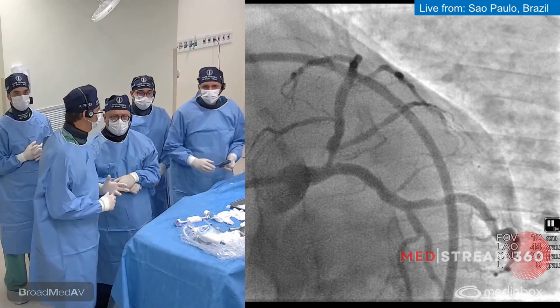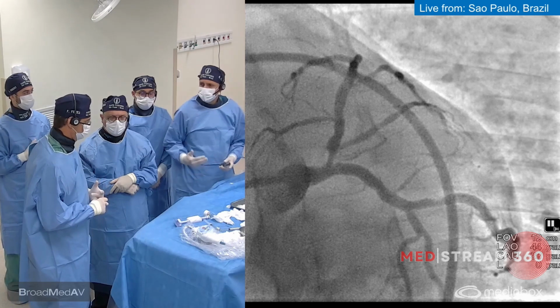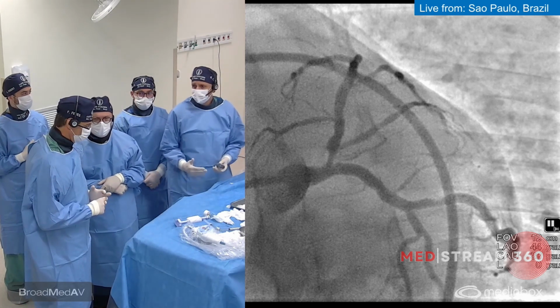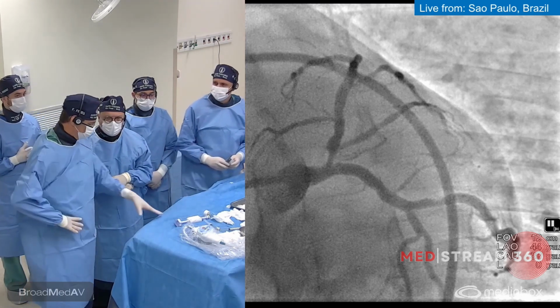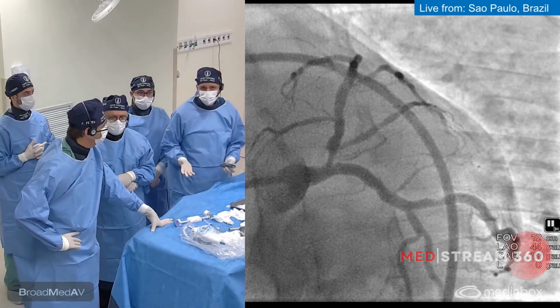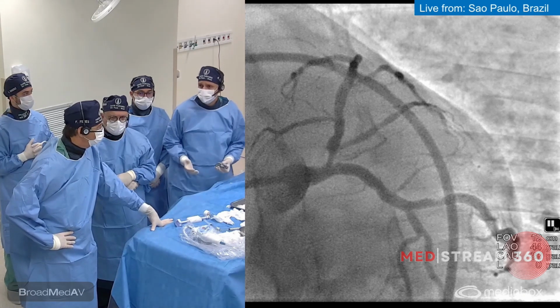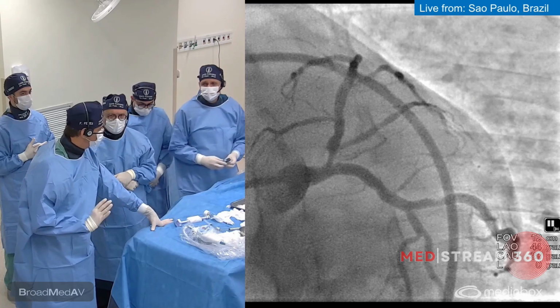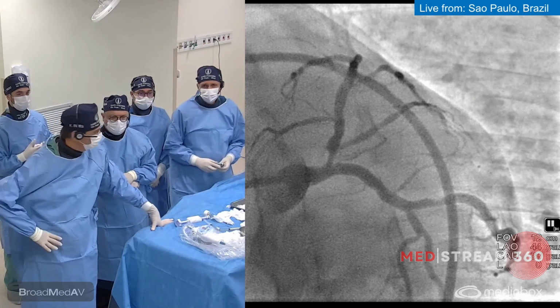Okay. So, does she have any stress test? She didn't have a stress test. She's only on optimized medical therapy and with worsening symptoms now, but it's a stable angina. This is the case. Should we do FFR? Also, it's always possible. It's a very proximal LAD, but this patient has symptoms. She's a young lady, usually they have symptoms. Yeah. They have some chest pain. Yeah. For this lesion, I don't know.